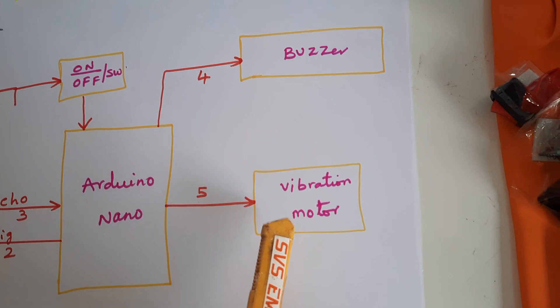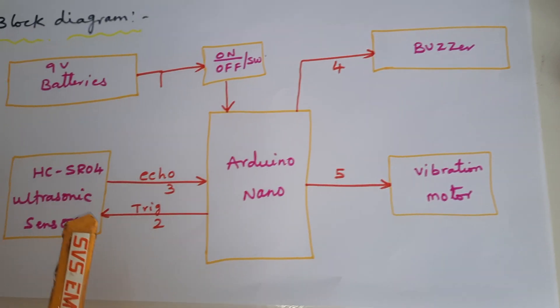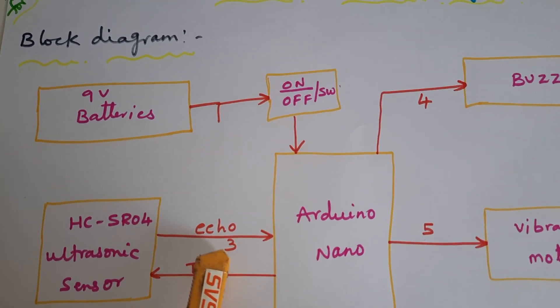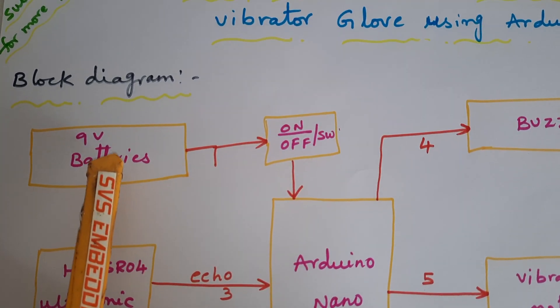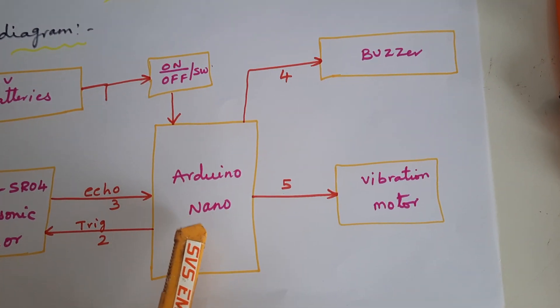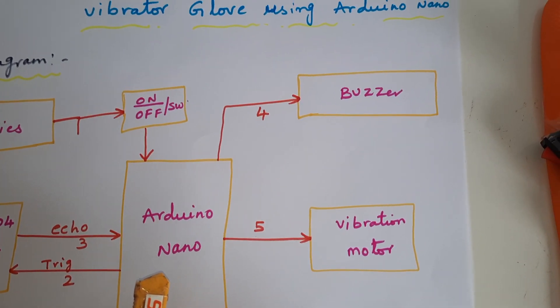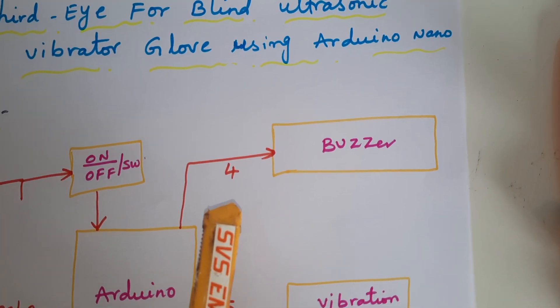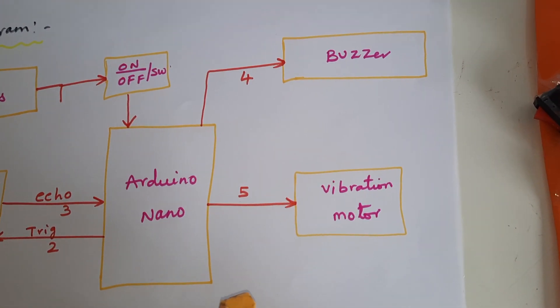The ultrasonic sensor is connected to the trigger pin D2 and echo pin D3. We are using two 9-volt batteries and an on/off switch button, feeding into the built-in regulator of the Arduino Nano, which takes a 5-volt power supply. The buzzer is connected to pin D4 and the vibration motor is connected to pin D5.